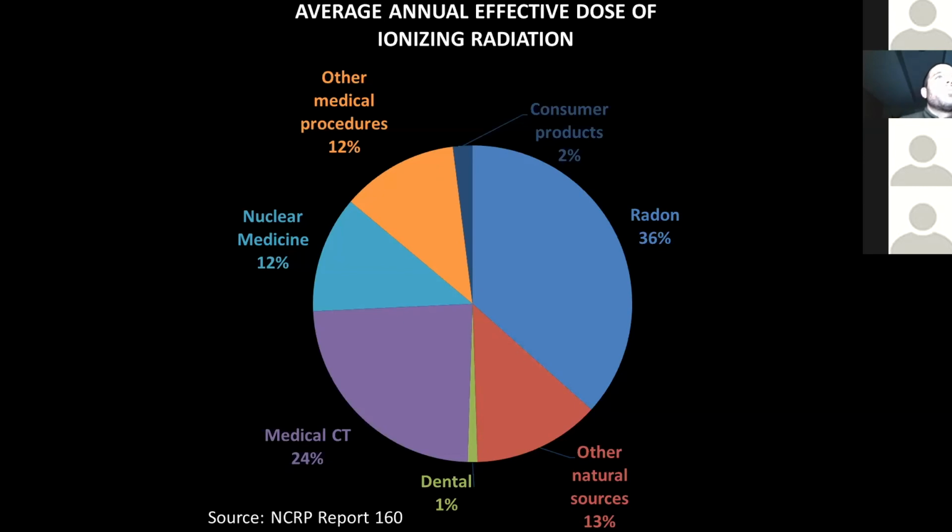PSP is phosphor plate, right? Yes, absolutely. And apologies if I skipped right through that. Those are the little flexible things that you take the digital image on and run through the scanner. They're supposed to last forever, but they don't. And they're annoyingly expensive to replace, though not as expensive as direct digital sensors. But that's what we're talking about there. Sorry for my additional commentary.